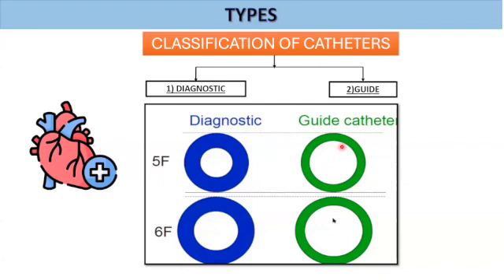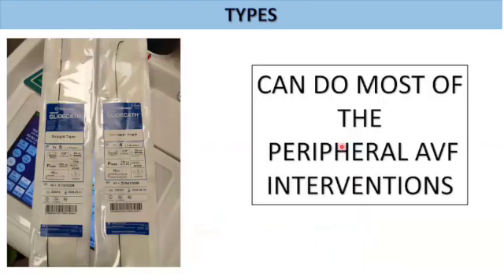Most of the catheters which interventional nephrologists use are diagnostic catheters. Guide catheters are rarely useful for us. Guide catheters are more found in the cardiology labs rather than interventional nephrology labs. So when I went during my fellowship, these two, one straight hydrophilic catheter and one angle hydrophilic catheter, did most of the job. Coming to SGPGI, these catheters do most of the job.